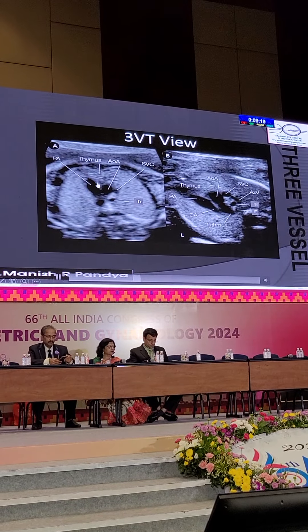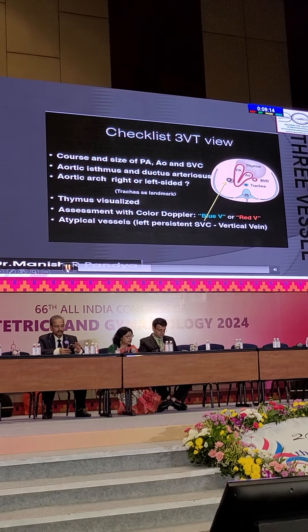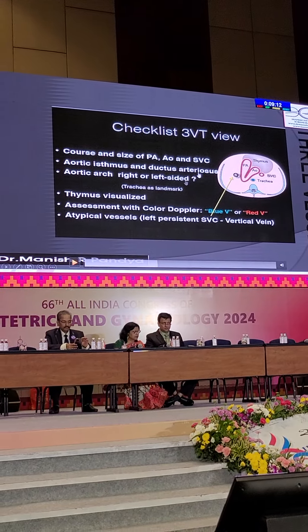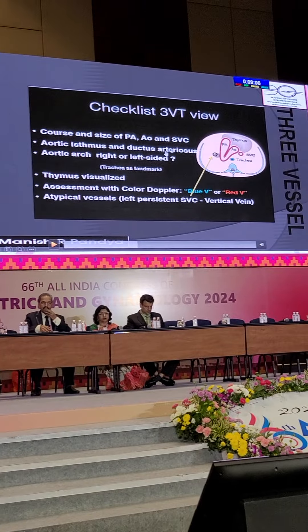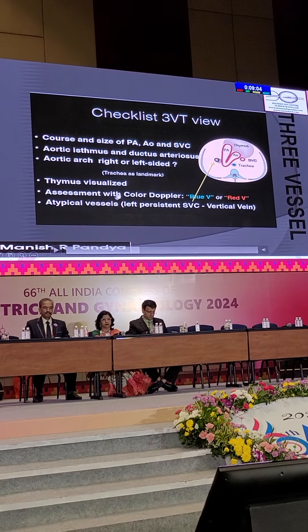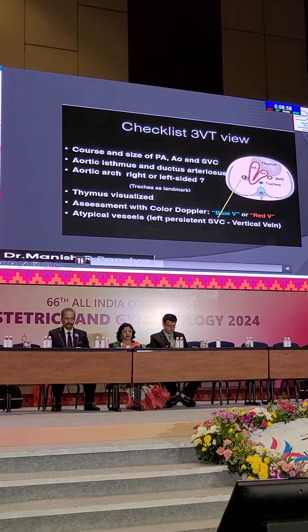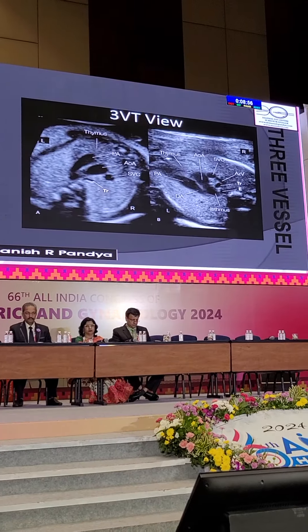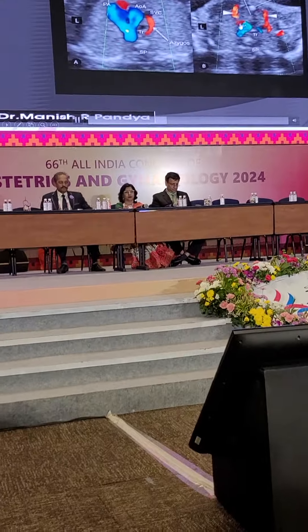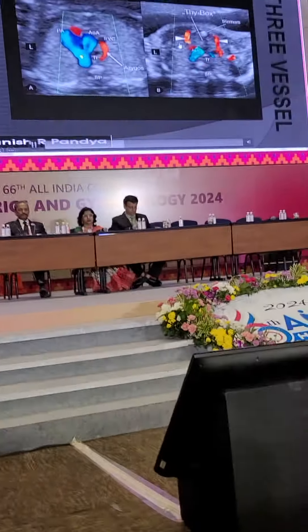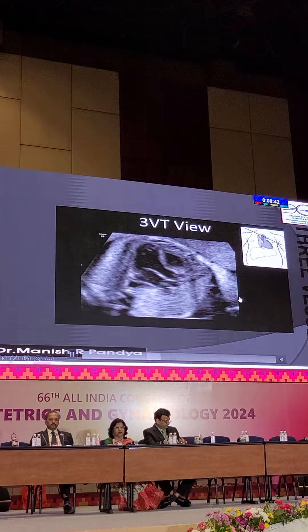This is a typical three-vessel view, and the thymus is always coming in as a bonus — we are not specifically looking at it. The checklist for the three-vessel trachea view: always see pulmonary, aorta and superior vena cava — they always decrease in size. Thymus is visualized as a bonus. If you put color, flow is seen either in blue or red, or it is inverted. Sometimes you can see a fourth vessel — that is a persistent left superior vena cava. In a typical three-vessel view, you can have an inverted V-shaped color pattern.